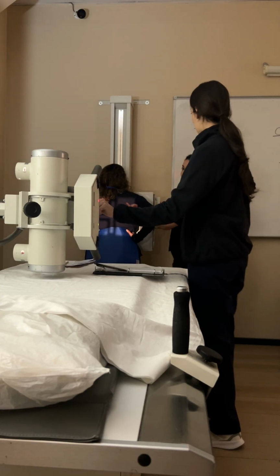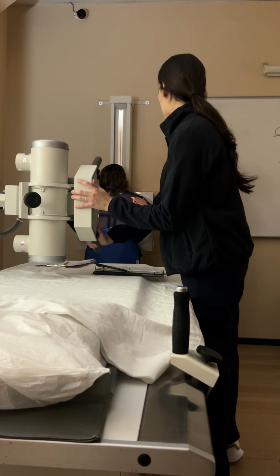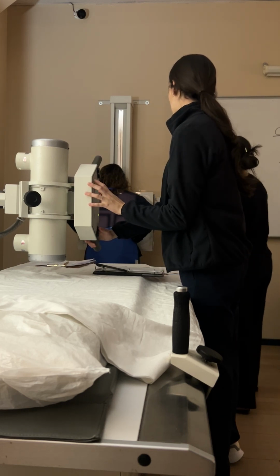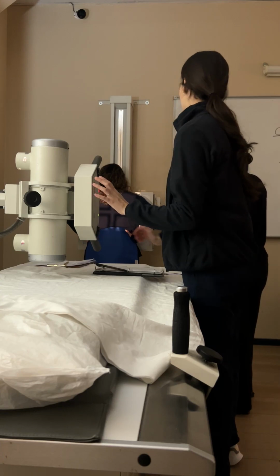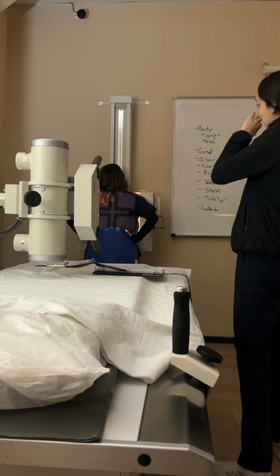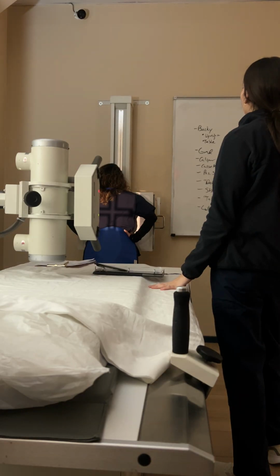No, move the machine up. Yeah, I would do that. Yeah, that's a perfect x-ray. Okay, so don't move. You're going to inhale, take a deep breath. Exhale, take a deep breath and shoot. Okay, you're all right.